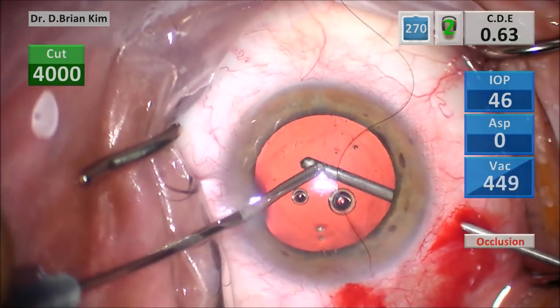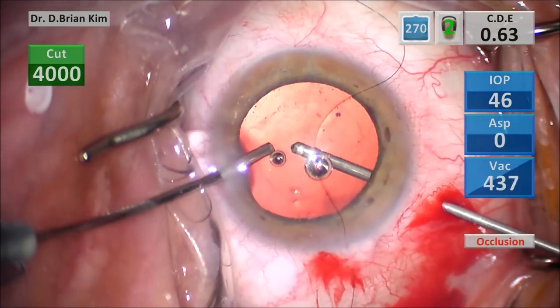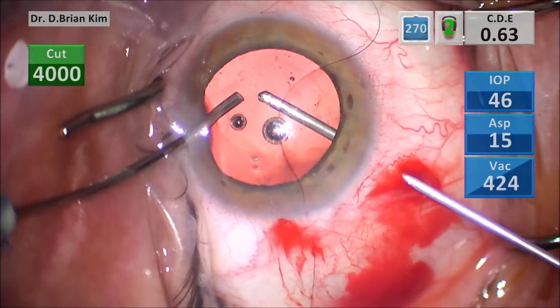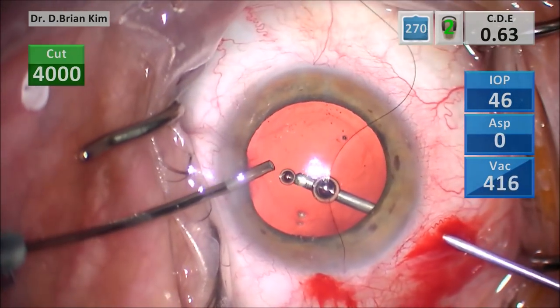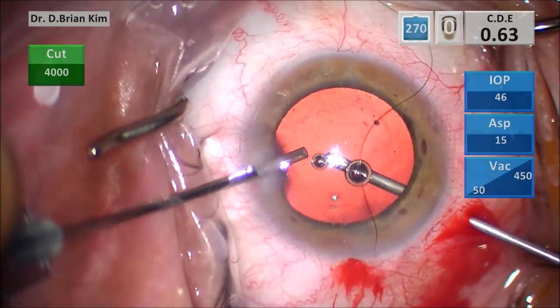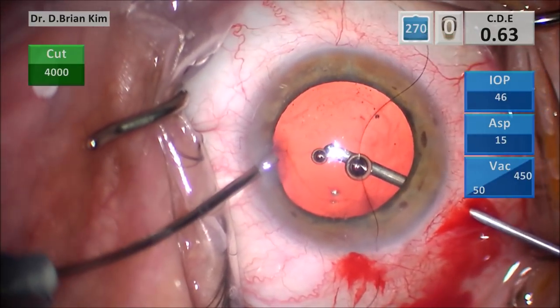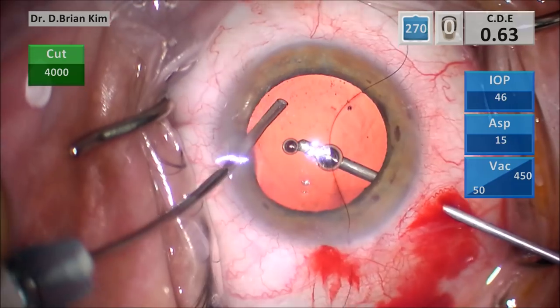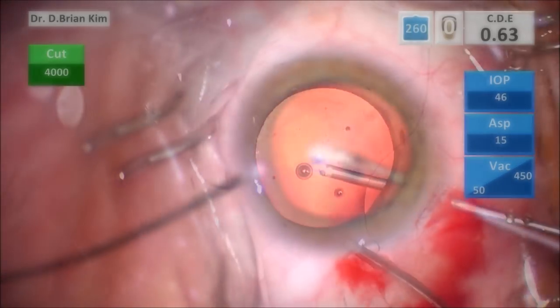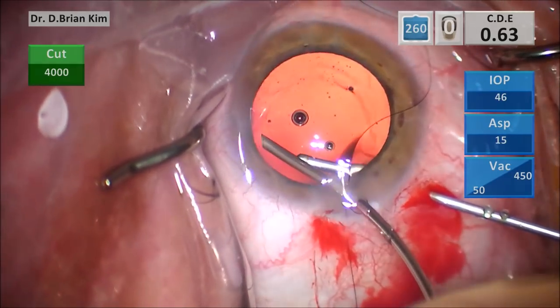And going back to how I ruptured the posterior capsule, obviously I had very high vacuum and I had that teeny tiny fragment, and it was at or below the level of the iris plane. I shouldn't have had the phaco tip so close to the posterior capsule, or at least I should have been using much more gentle vacuum instead of such high vacuum.